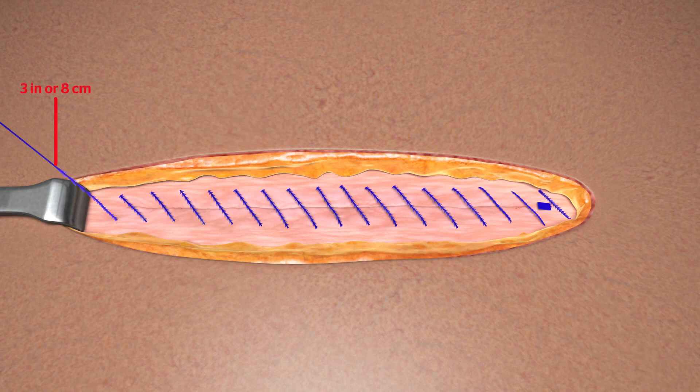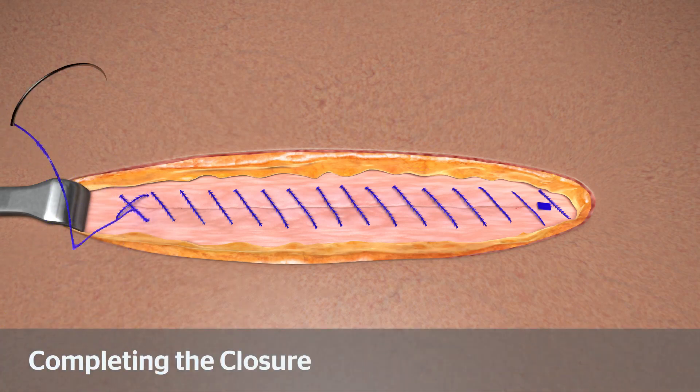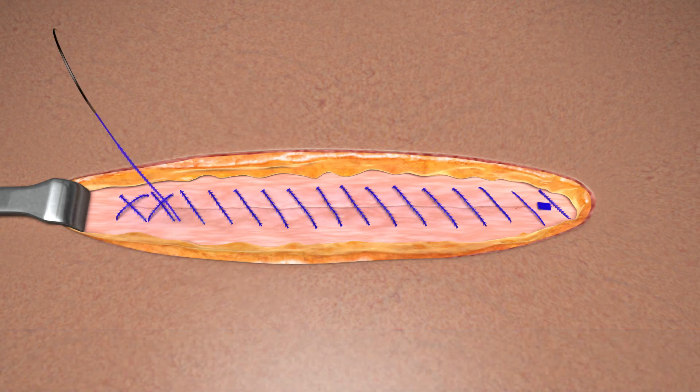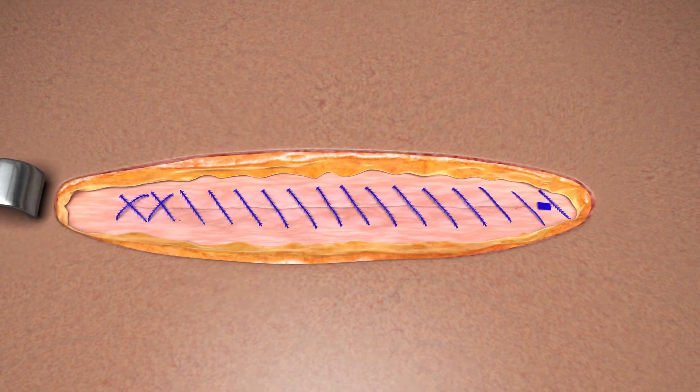Retain approximately 3 inches or 8 centimeters of the device for completing reverse stitching to secure the terminal end. To complete and secure the closure, take two passes in the reverse direction across the incision, then gently pull on the free end of the device and cut flush with the surface of the tissue. Closure is now complete.